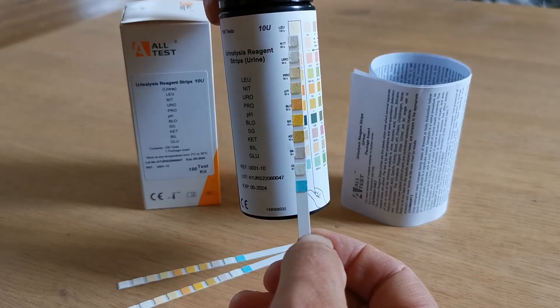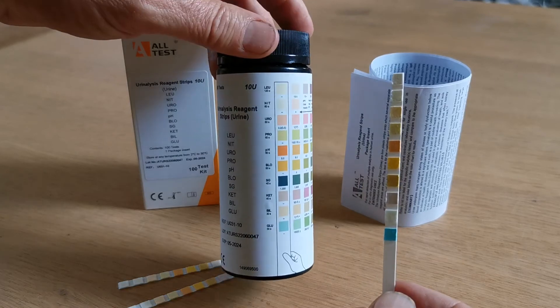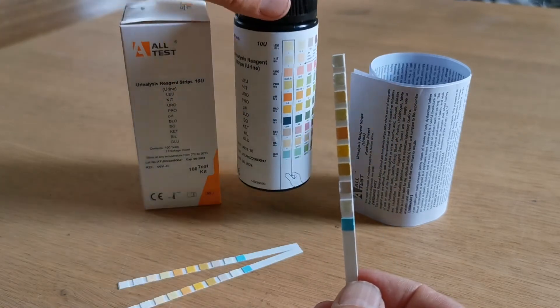The read times are specified under each of the abbreviations for the parameters. Leukocytes is the longest at 120 seconds and glucose the shortest at 30 seconds.